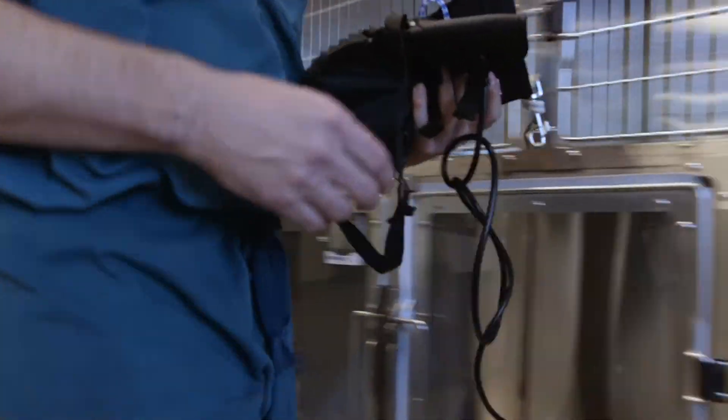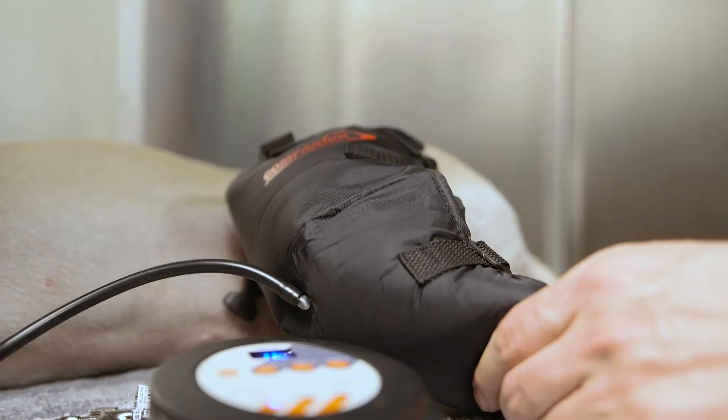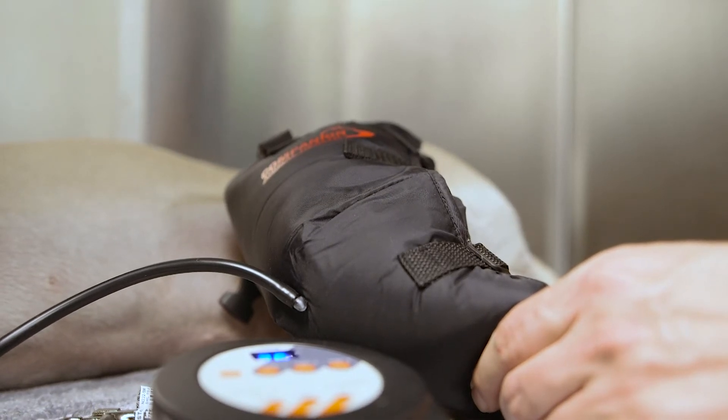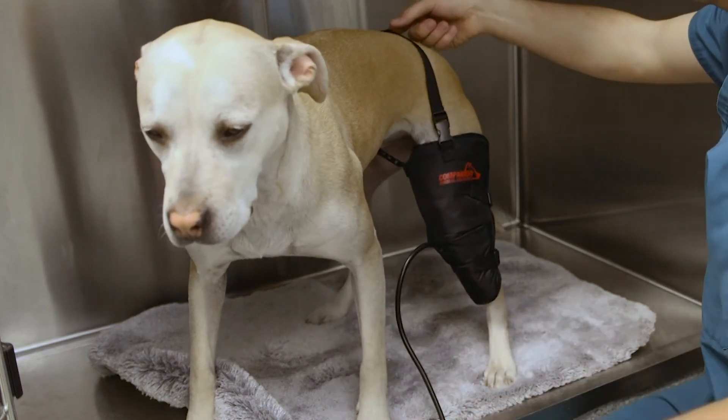One of the things I really like about the system is its portability. Charge it up, ready to go. We can take it from the operating room to the ICU, to the rehab department, to home with the patients without a lot of clunky things to try to carry around. We have intermittent compression, so we can apply some compression and allow that to relax, get some better blood flow in that area, and then compress again to return all the swelling up into the lymphatics and back into the body to eliminate it from the limb.